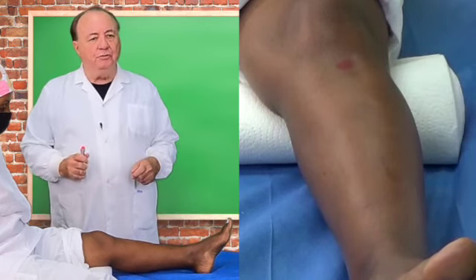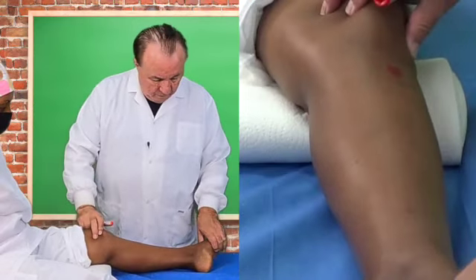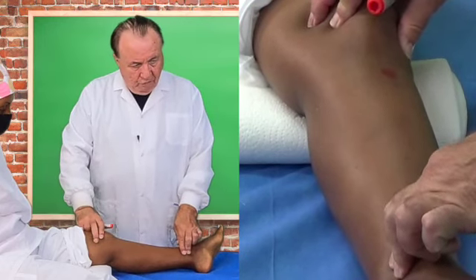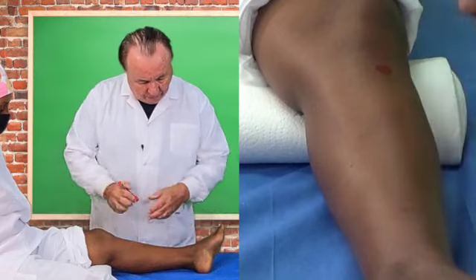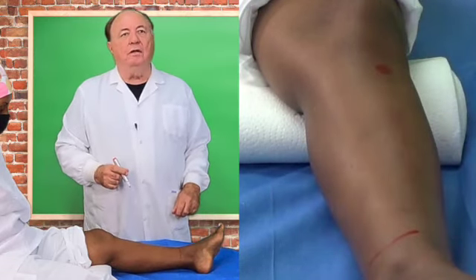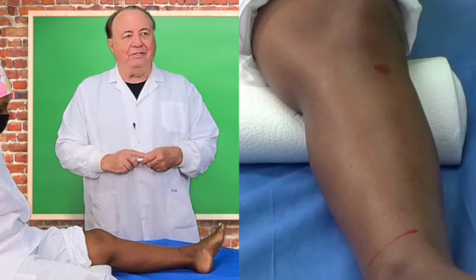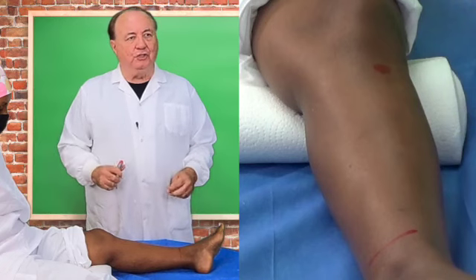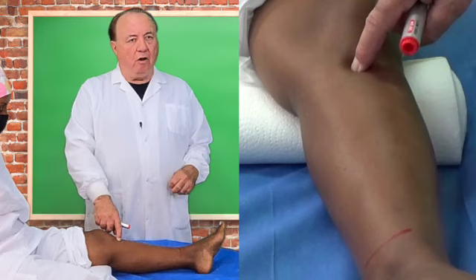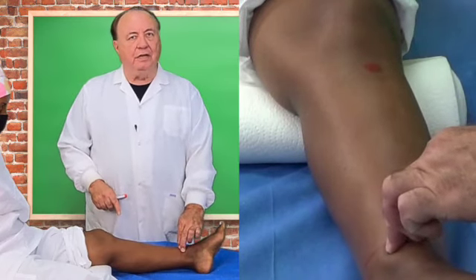If you are choosing to do a long saphenous vein cut down, you have to find it. You find the medial malleolus. You go 2 finger breadths up, 2 finger breadths over, and that is where you will find your long saphenous vein. So for tibial access, lower leg superficial anatomy is important. The tibial tuberosity for interosseous infusion, the medial malleolus for long saphenous vein infusion.